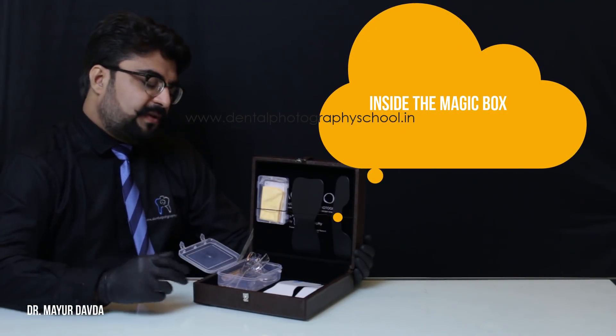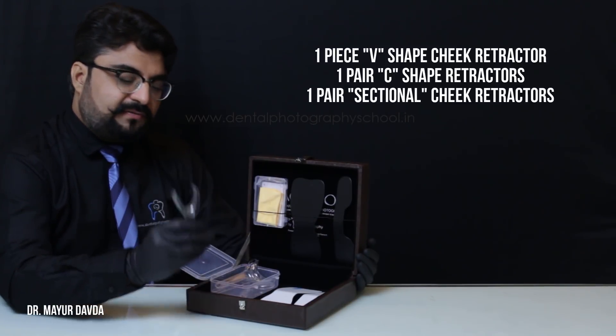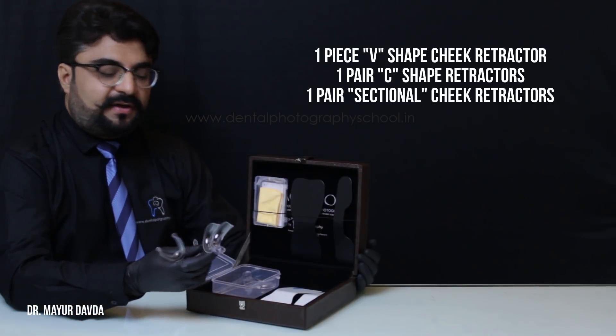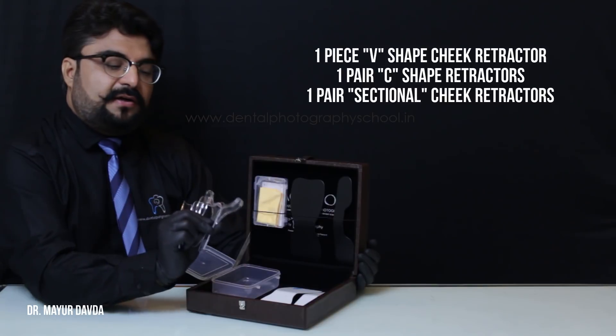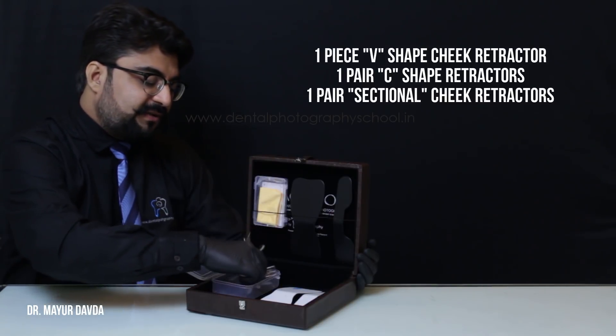Inside the magic box, we have transparent cheek retractors: one single unit V-shaped cheek retractor, a pair of C-shaped cheek retractors, and two sectional cheek retractors or quadrant retractors as we call them.